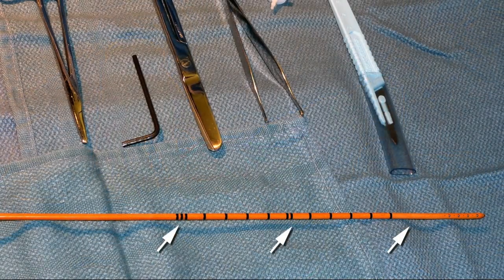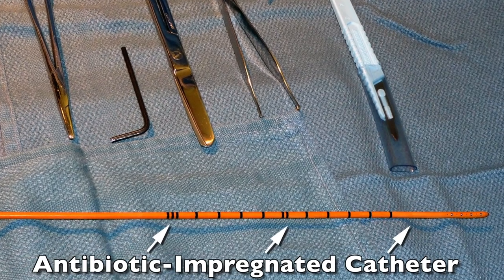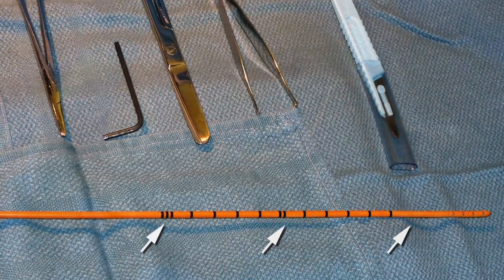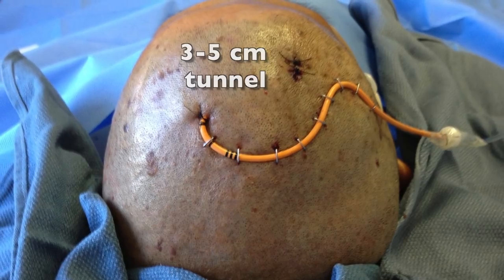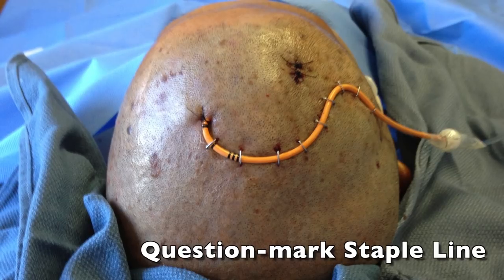An antibiotic-impregnated ventricular catheter is then placed with standard surgical technique. After tunneling 3 to 5 centimeters from the incision site, the catheter is secured in a question mark pattern with a line of surgical staples.